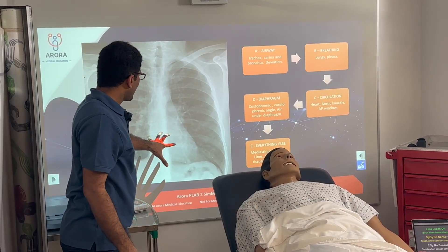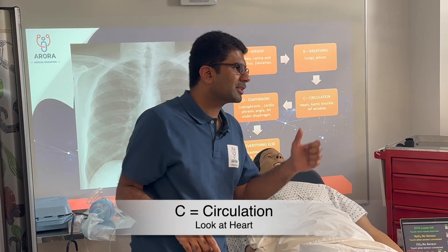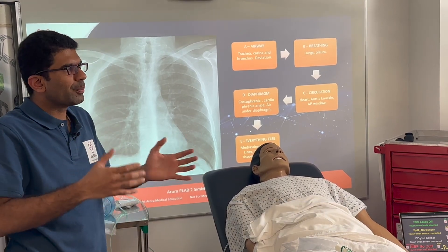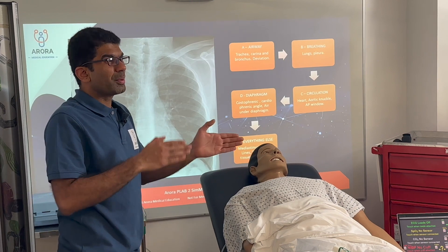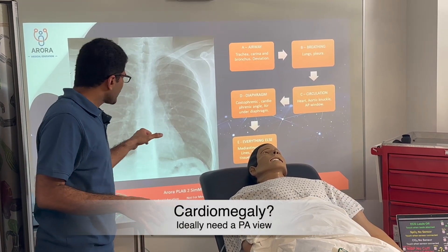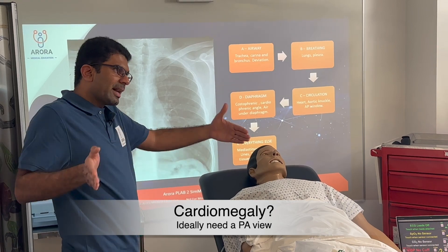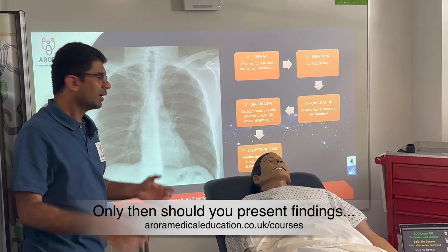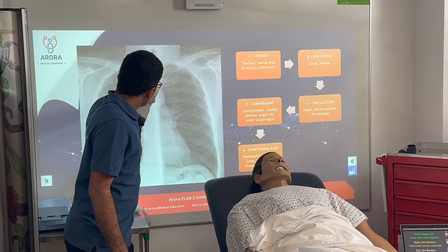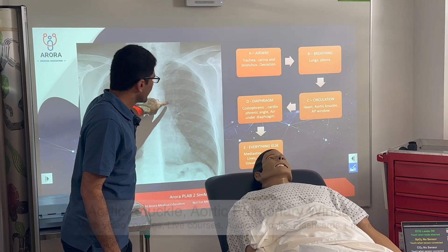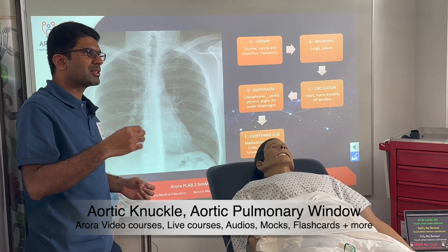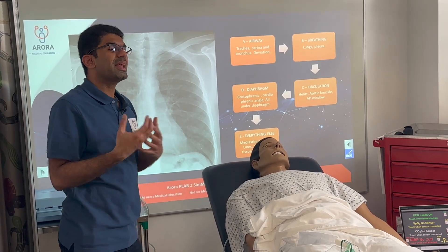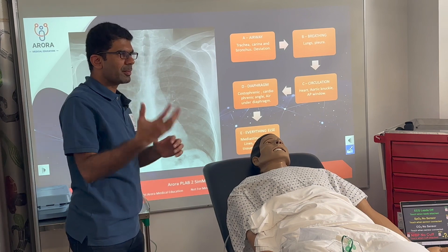C is for Circulation — you look at the heart. Remember, in an AP view the heart will appear a bit enlarged, so you can't comment on cardiomegaly on an AP view. You look for a PA view for that. Approximately, the heart should be less than 50% of the entire thoracic width; if it's more than that, you have cardiomegaly. Starting from the top, you have the aortic knuckle and then the aortopulmonary window. The aortic knuckle may be lost if there's an aneurysm, and the AP window may be obscured if there are enlarged lymph nodes from malignancy.